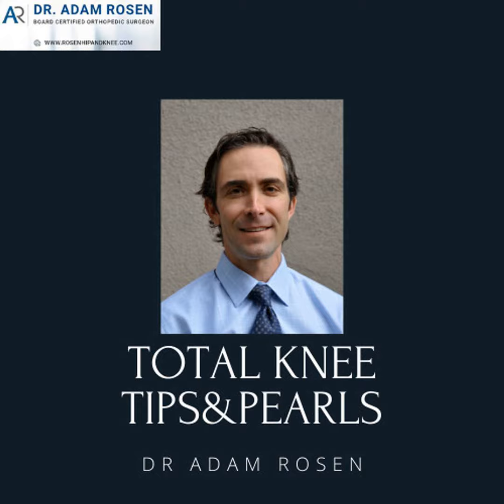So these are a bigger deal. These you have to prepare for. Maybe you're calling in some bulk allograft. Maybe you get some sort of custom implant, but I think for the most part, with what is available now as far as revision stuff, you can usually get away with other things. But this is where you're most likely going to be using a sleeve or a cone, having a hinge available because you're not sure about the stability of the collaterals.